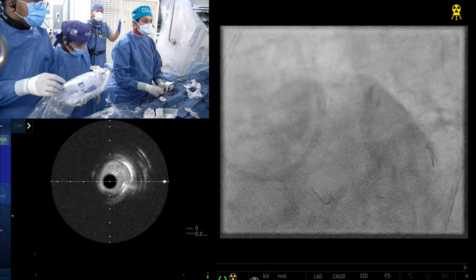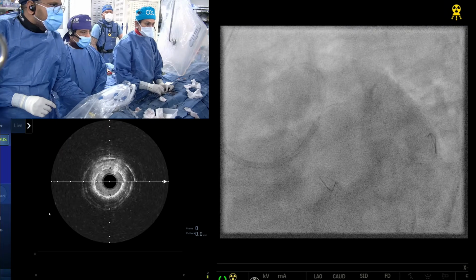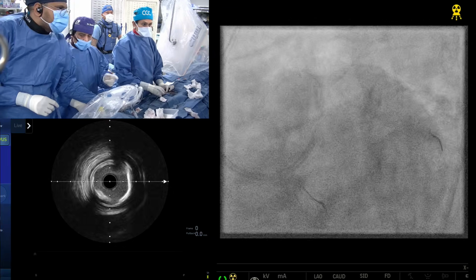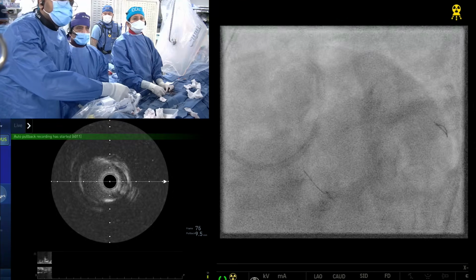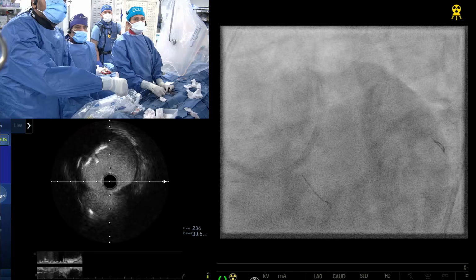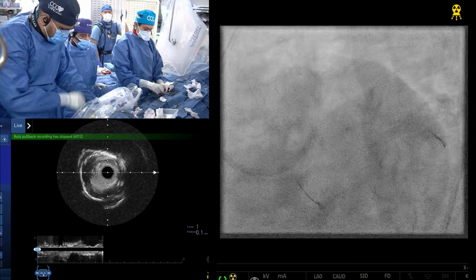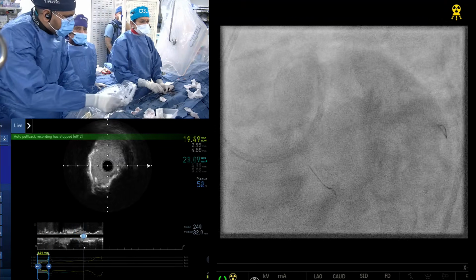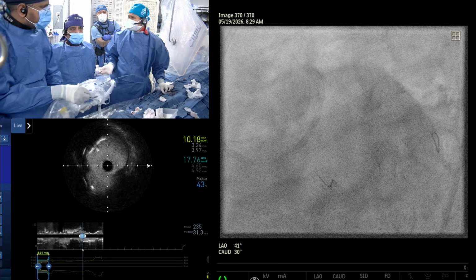Okay, I'm going to the ostial circumflex. Sure, IVUS. How was your experience doing so many cases with that? How does it compare with the existing IVL? So I think that it is more flexible. And secondly, the setup is very clear. You don't have to get extra coverage, feedback. You just basically connect it. And so all these companies are working on that. Each cycle is less than 10 seconds, so that causes less ischemia. Even our current Shockwave is coming with the 5-second runs.